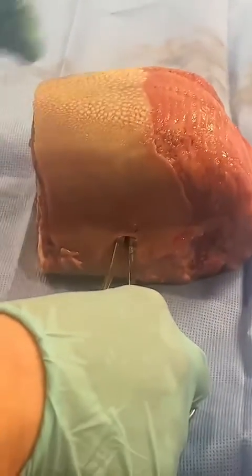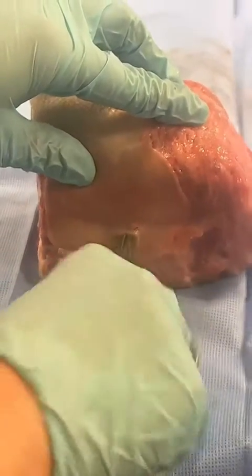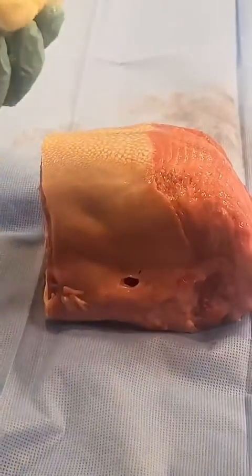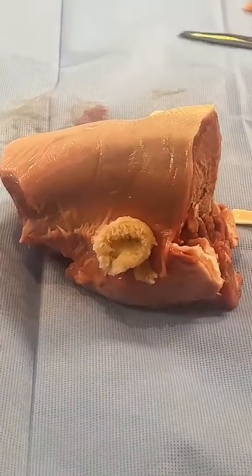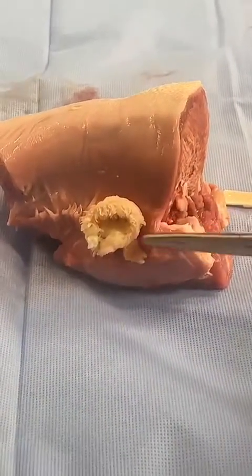What my fellow is doing here is she made a tunnel through the cow tongue and is pulling through a tube of rectal mucosa, which is the tripe. It'll take a little bit, but that's going to be tunneled through and pulled through to make the rectal mucosa. This is what it looks like after the tripe is pulled through.